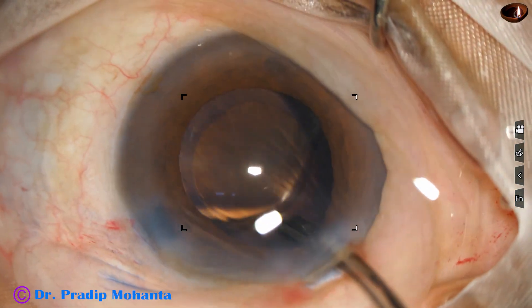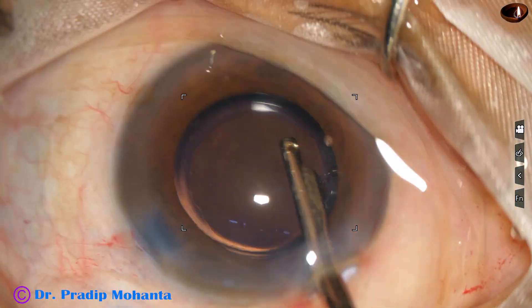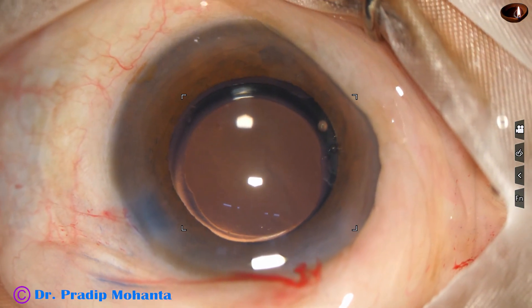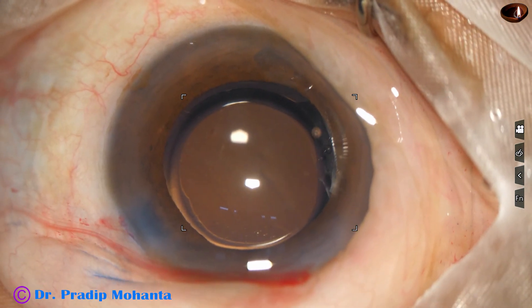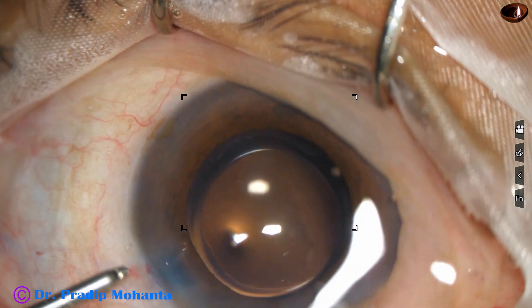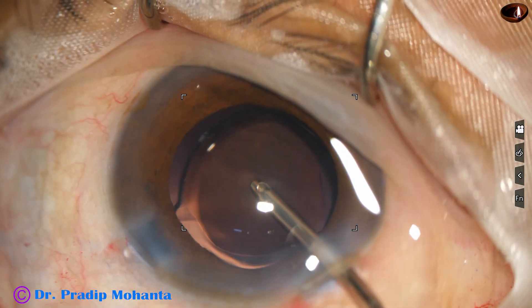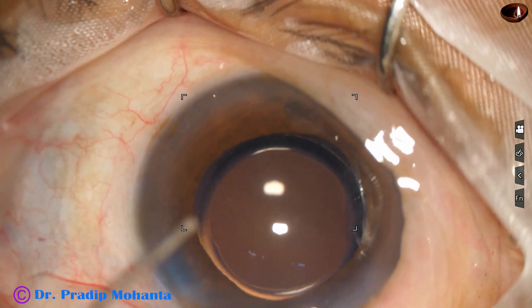Now is the time to clean the viscoelastic. First I use 23-gauge Simcoe, and then I use bimanual irrigation-aspiration cannula. I usually use both Simcoe and bimanual I/A because thick viscoelastic substance, if removed first with Simcoe, becomes more manageable. Then when the visco molecules are fewer, the bimanual I/A can remove it faster. I always go behind the lens and irrigate the capsular bag — removing all the visco from the capsular bag, from behind the iris, and from the angle of the anterior chamber.